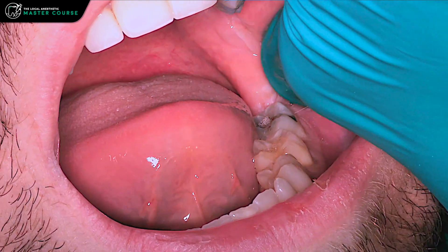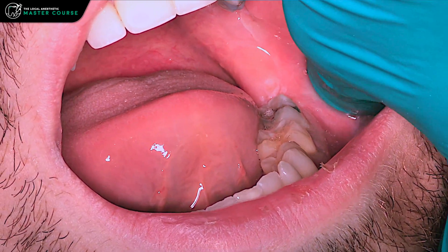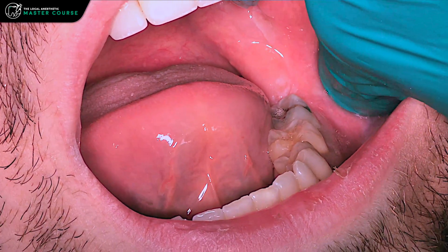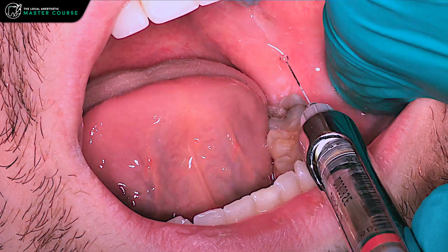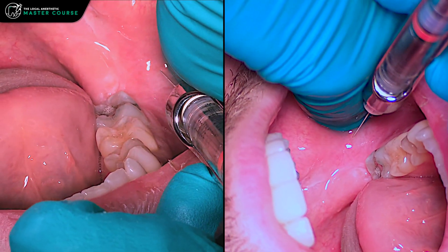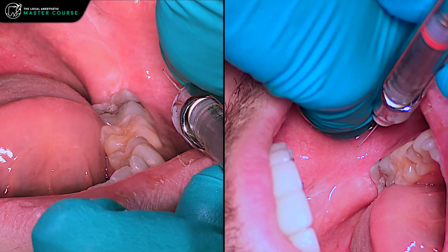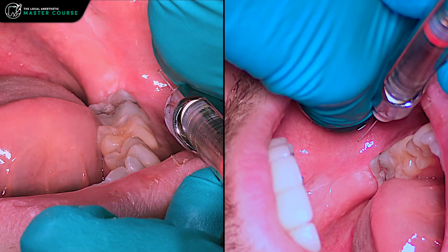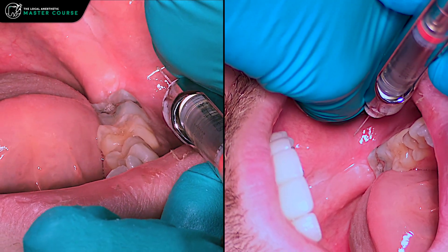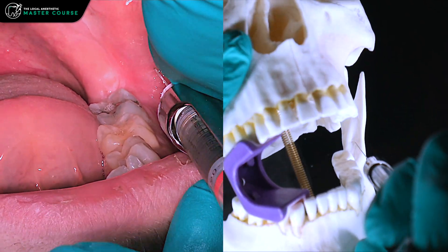With the injection, we're going to be just buccal to these molars, between the leading edge and the teeth, following the occlusal plane. We'll go ahead and do our insertion here. Often this can be a bit of a poke — I find some patients find this more uncomfortable than the actual inferior alveolar nerve block. We're going to aspirate and things look good.